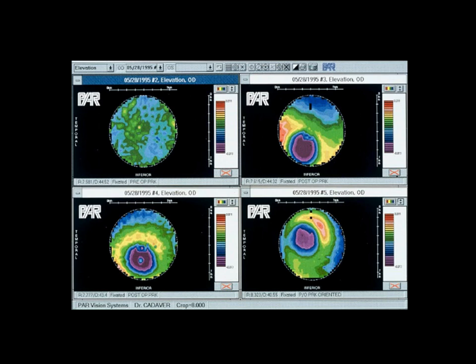Then I moved the cornea up a little bit. You can see the ablation moves up. And then in the picture on the lower left, you'll see I just moved it back down, but a little bit more to the right. It wouldn't be difficult to convince you that these three maps with the post-ablation are the same cornea, just that they've been changed in orientation. Again, the football with the laces, and all I'm doing is moving the laces. But it still looks like a football.